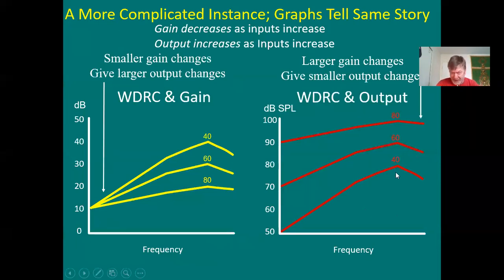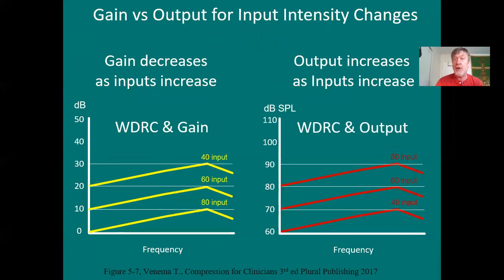That's a little bit of a misnomer, but if I'm looking at the peak at the 40 here, I'm getting 40 dB of gain for 40 dB inputs, well, then my output is 80. And again, don't freak about it. Just let the graph tell the story. When you're talking gain, things are read totally different than when you're talking output. We are now caught up. This was our review. Now we'll proceed ahead.